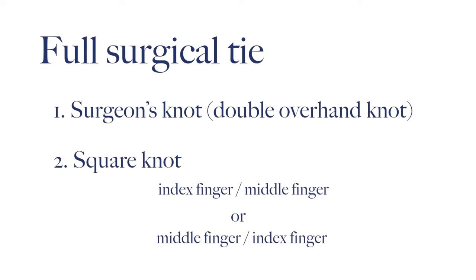For a full surgical tie at least three single knots are needed. The beginning is made by a double overhand knot followed by a square knot which contains two half knots, either an index finger middle finger combination or a middle finger index finger combination.